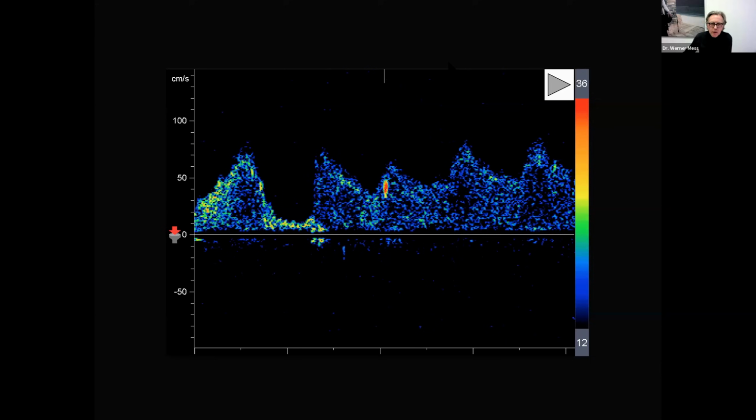And that occurs here. The bloodstream is blocked. Obviously, the intracranial collateralization is very bad, so we have hardly any flow in the ipsilateral middle cerebral artery anymore. And one heartbeat later, we have the embolus. So before I go on talking, let's listen to this.